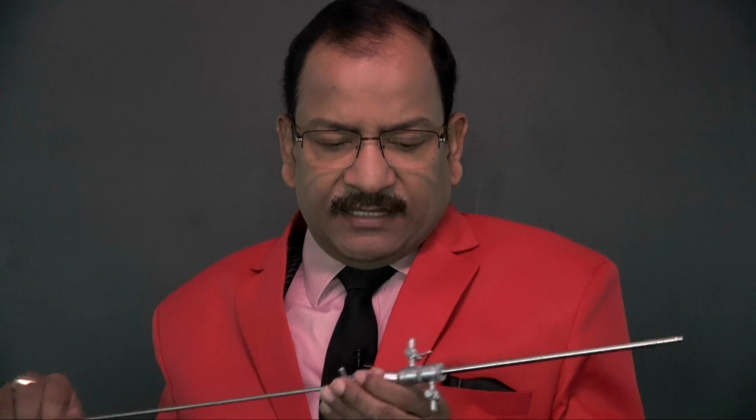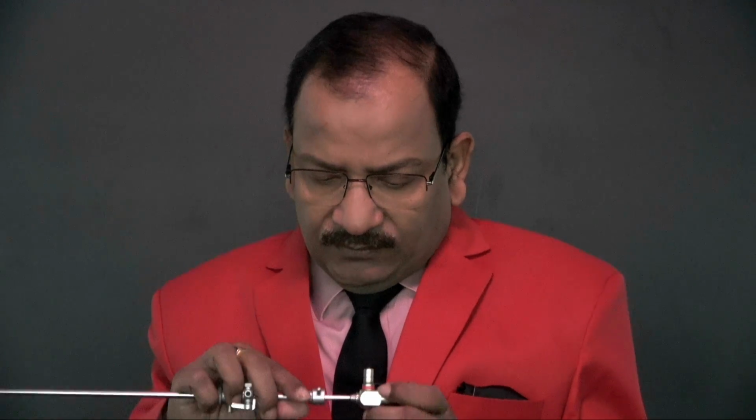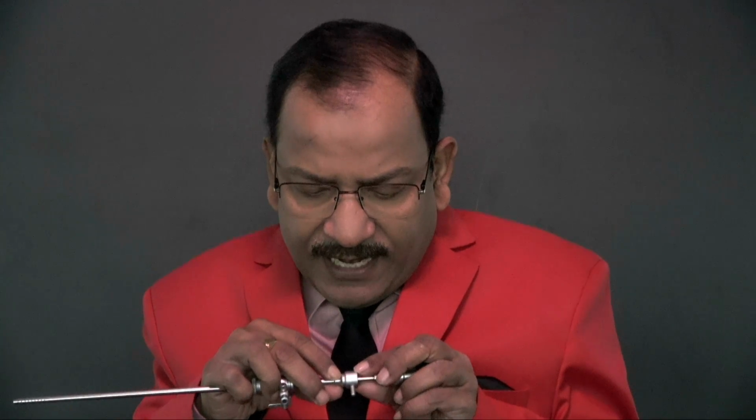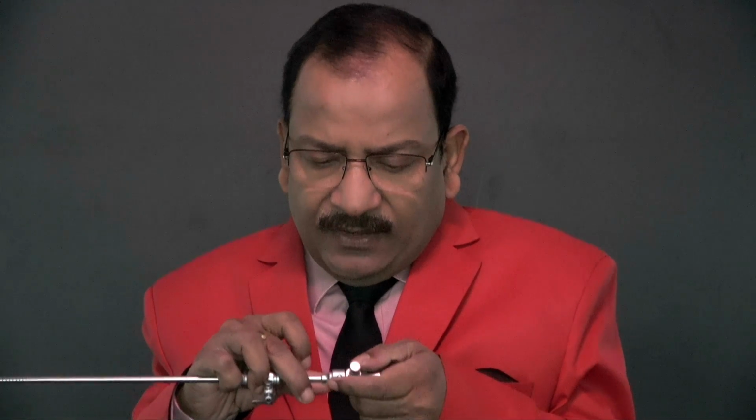After that, you have the double channel sheath. This is double channel. In the double channel sheath, similarly here also you have two lines. Both lines here, one line here and one here, are attached parallel, and then again rotate. Now here the fluid input and fluid output are away. And always remember how you will know which one is fluid in and which one is fluid out.